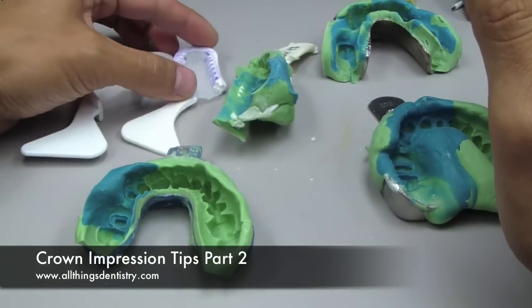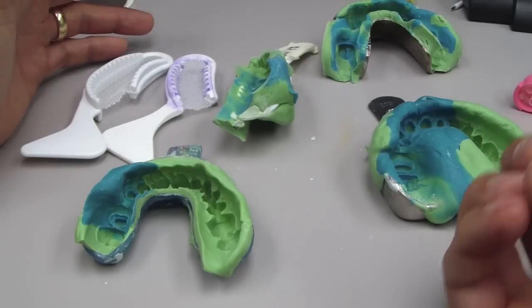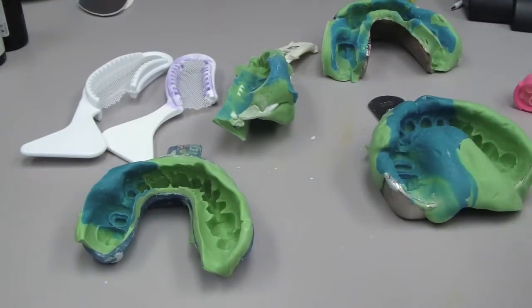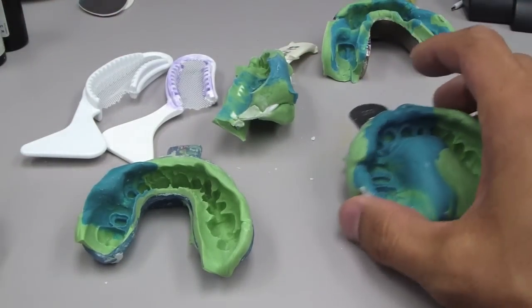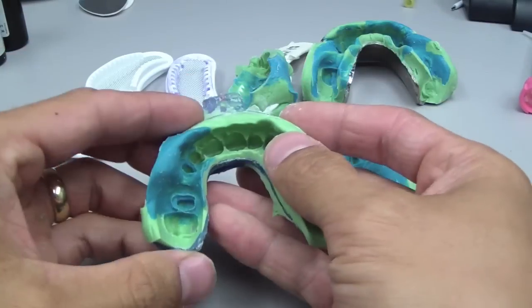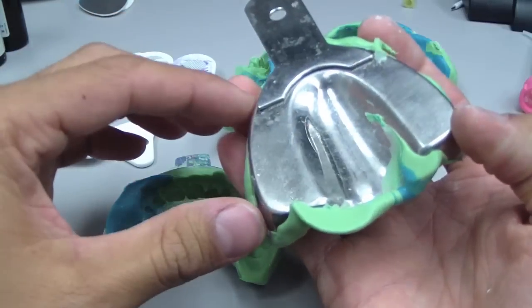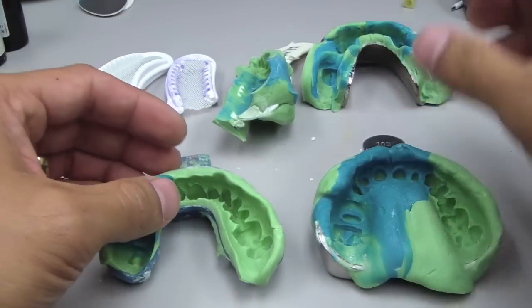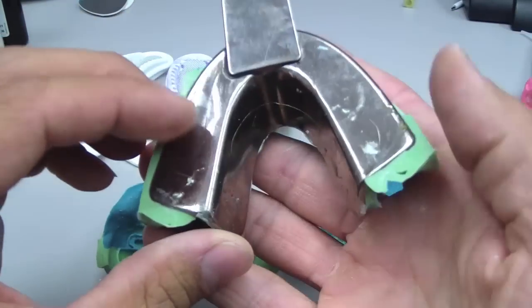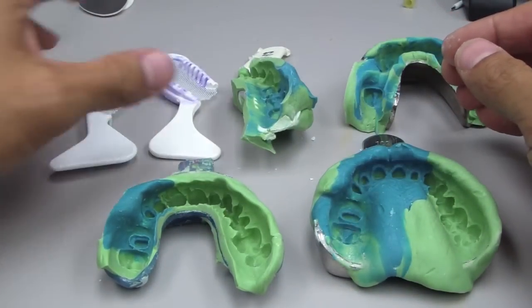Let's talk about the trays — that's a fairly important part. We're going to use some sort of tray until we go entirely digital or optical; we need something to capture and hold on to our impression material. So we've got custom trays, U-shape — this is for a maxilla — and this is the same patient with a stock tray. This is a horseshoe dual arch, triple tray that we've all seen, and a couple of triple arch trays.